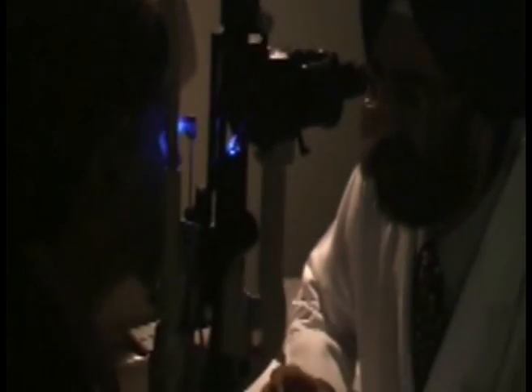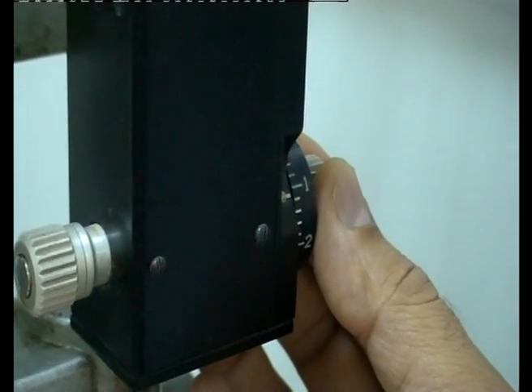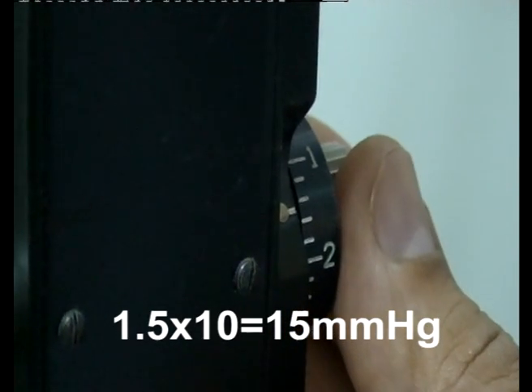After obtaining contact, observe the cornea through the microscope. Regular pulsations of two semicircular rings of equal size show that the tonometer is in the correct position. These pulsations represent cardiac cycles. The drum is rotated to adjust pressure on the globe until the edges of both rings just meet at the midpoint of these pulsations. The reading is then multiplied by 10.